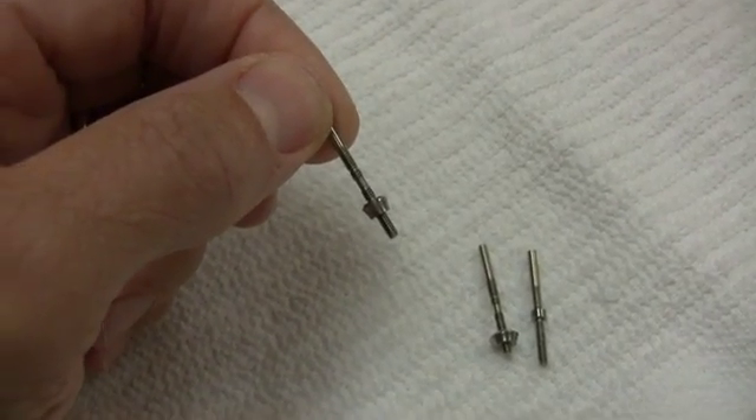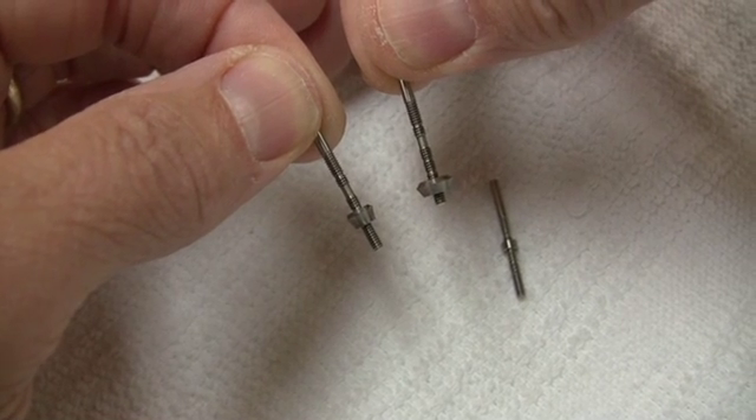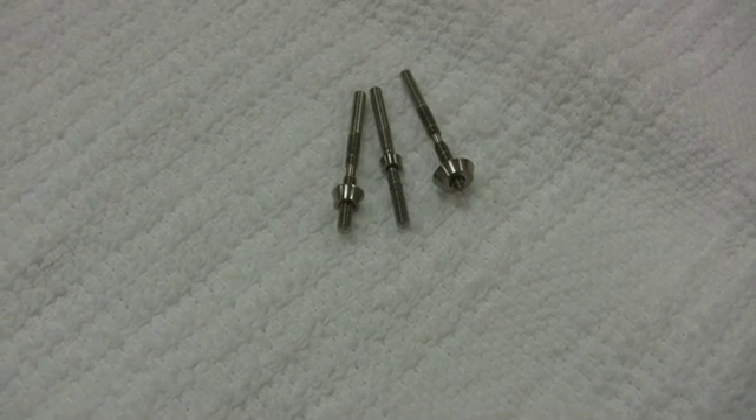Modifications are made to the crest of the ridge to position the implant platform in the proper vertical position, allowing fabrication of aesthetic restorations.